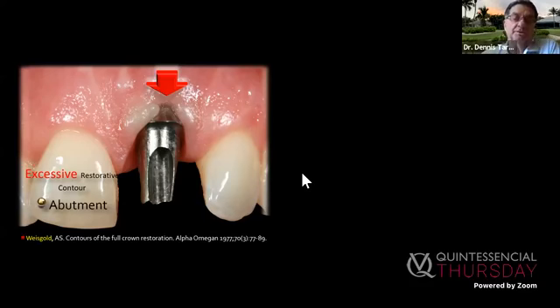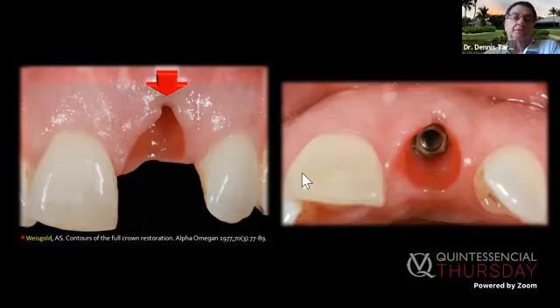One of the good things here is that the implant was deep enough and the papilla are intact. So this is strictly a mid-facial problem. Can we fix this? The implant is healthy. So when we take it off, take a look at this distance here.